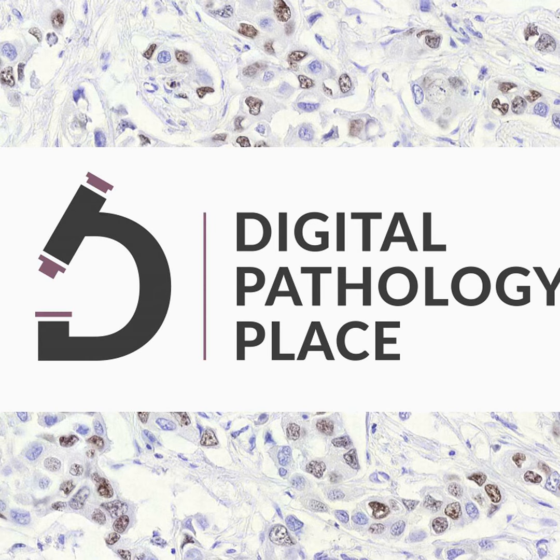When you do PCR or any other test, there's always a lab validation that you have to go through, even though these methods are well established, right? Our AI methods are semi-well established. We're just starting with this, right? What they did, they have this artificial intelligence assisted digital cytomorphology, and they have an abbreviation for this. Yeah, here, this AI-driven automated digital morphology, ADM, is automated digital morphology.